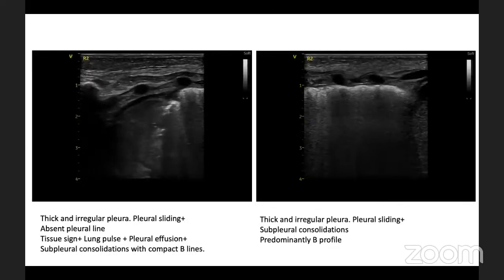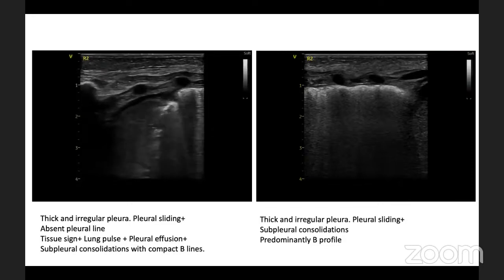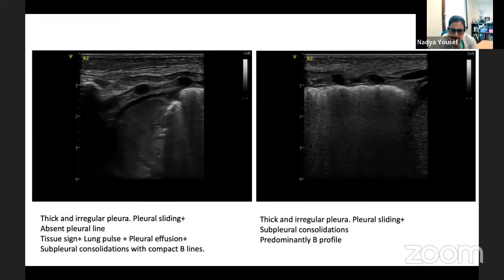This baby became unwell with line sepsis and was recovering from that, so was on a period of antibiotics when this scan was done. And how high was the CRP? So the CRP went up to 200, Nadya. The line was removed, and there was clinical improvement seen. Subsequently, the last two respiratory endotracheal tube secretions were negative. It didn't grow anything. It's a very interesting case.